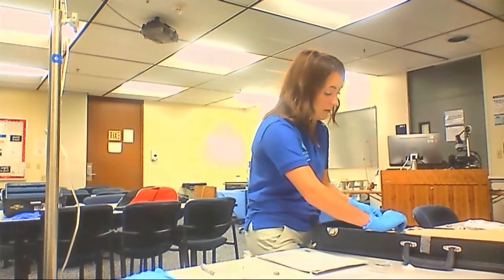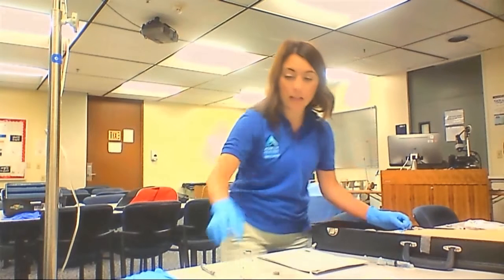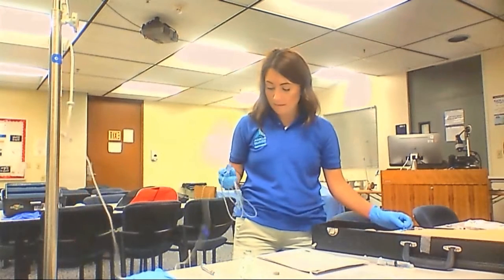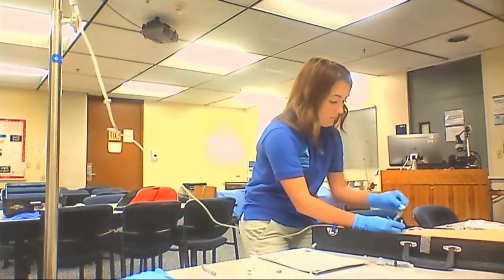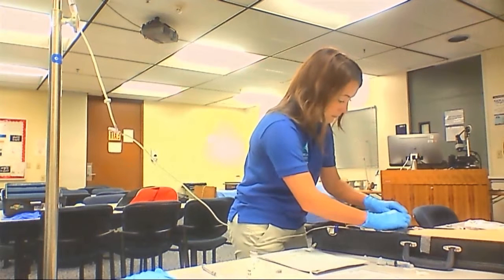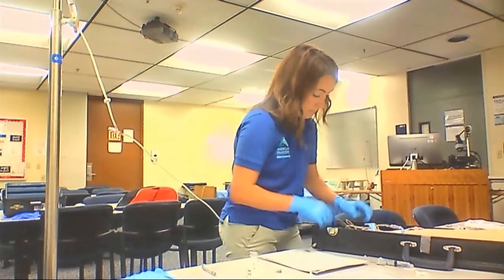Alright, so I will disconnect the flush. Then I can go ahead and attach my IV tubing. But before I do that, I want to make sure again that I go and clean, minimizing the risk for infection on both ends. So I can go ahead and get that set up.